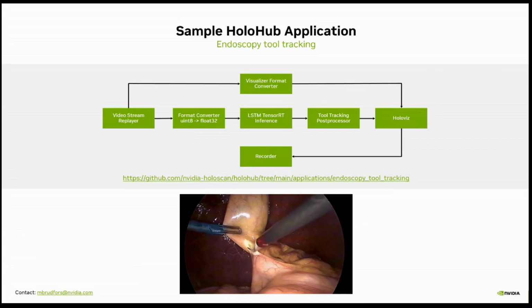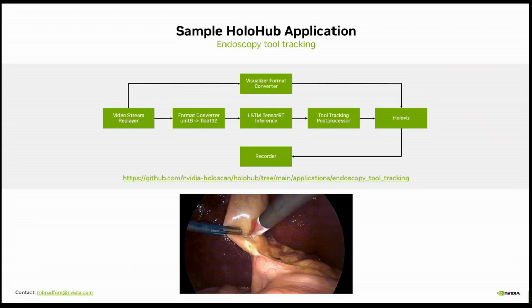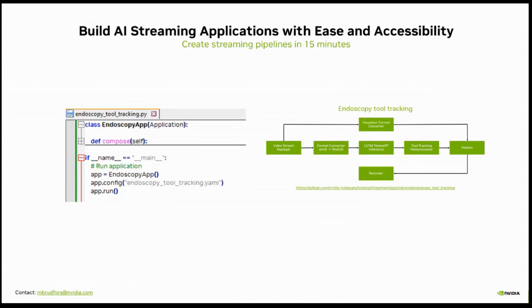But as I said, it's quite easy to write your own operators. You can literally in C++ link to whatever library you would want, or likewise in Python, have some package and just build your custom operator. This, by the way, runs as a container, so it's all Docker to make sure that all dependencies are easily available. So this is a high level, almost pseudocode run through what an application is like. It is Python, but not everything is here, otherwise it will be a bit messy. If you go to the actual GitHub link, there'll be more comments and so on.